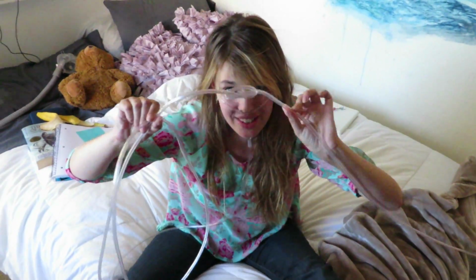One of the hardest things about having oxygen is actually being at home with it, surprisingly. Because you gotta think, this is a 75-foot tube running through your household. There are other people walking around in the house who don't always see it. Also, it's clear, so it blends into the ground. You have no idea how many times my mother, my sister, house guests, people with really pointy stiletto heels have all stepped or tripped over the oxygen. It's inevitable.